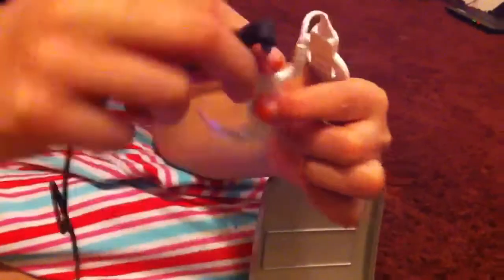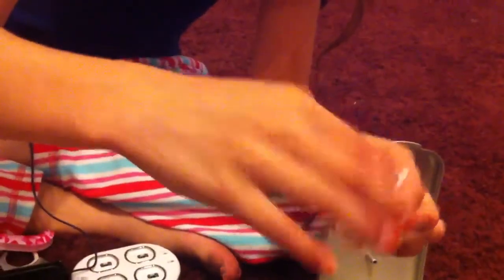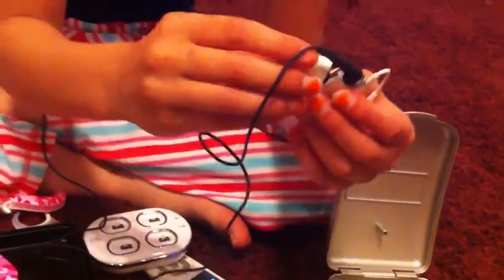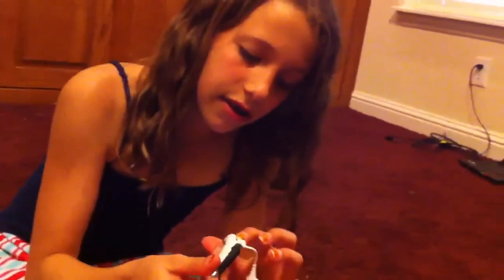You can connect it to an iPod, computer, Xbox, or anything — this part goes into the implant. This part can be tricky; you need a little latch. Don't forget to put the battery back in and turn it back on, and then you plug it into the device. It works pretty well.